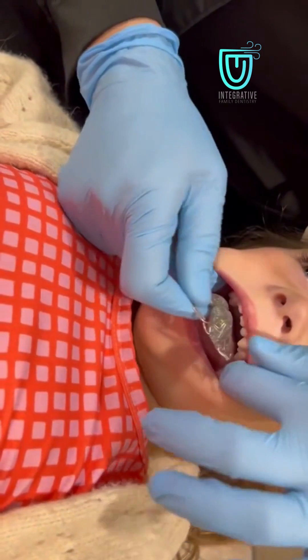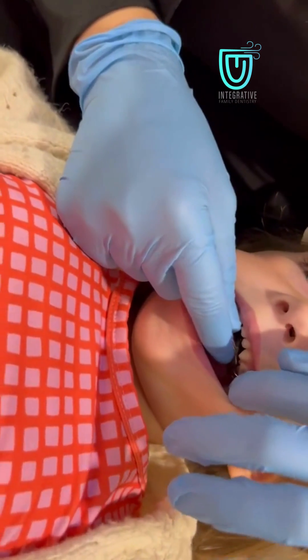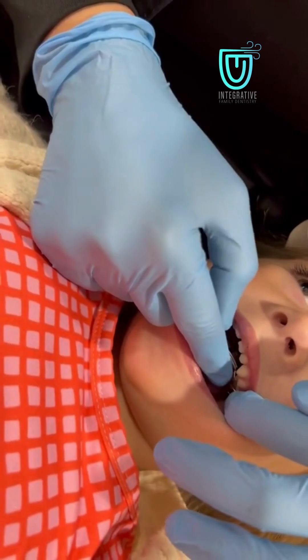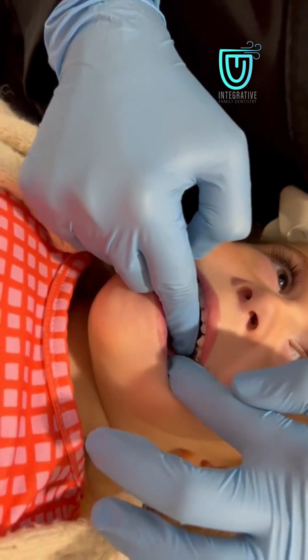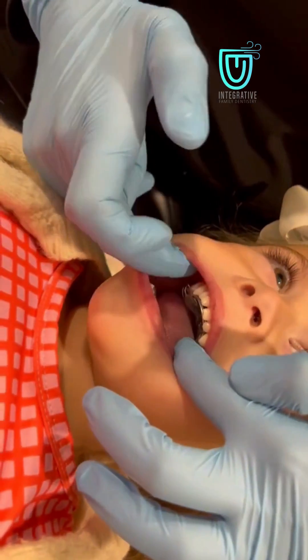This is on the last tooth that you see, and they go in like this. With this index finger I push it in between the teeth and it rolls onto the tooth, so it seats all the way on that side.